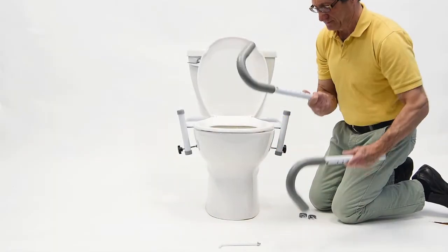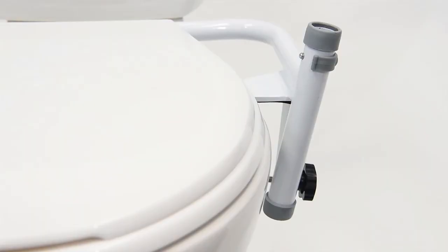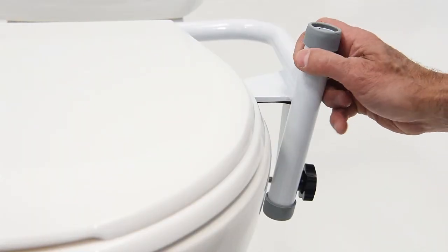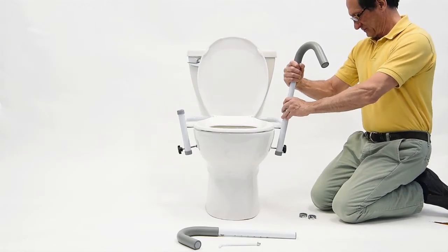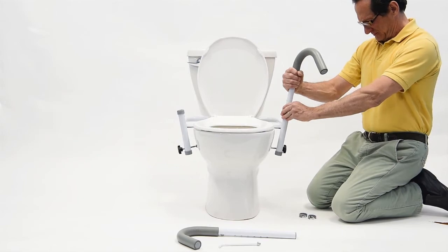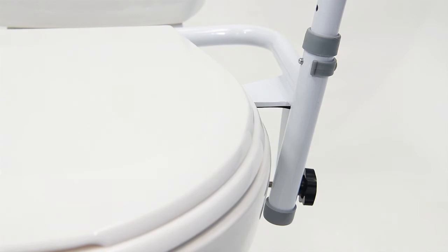Identifying which is left and right of the armrests is easy — the threaded toilet paper holder receiver will be pointed away from the toilet bowl. To install, first remove the C-clip from the lower portion of the Ultra Frame. Then insert the armrest into the frame and align the holes to the desired height. Reinsert the C-clip.